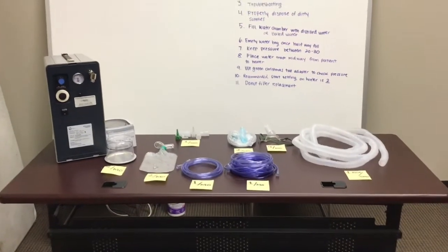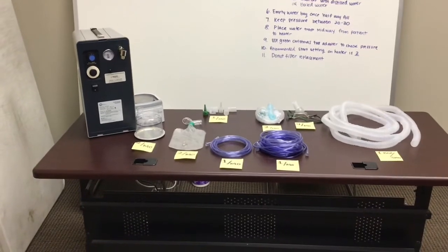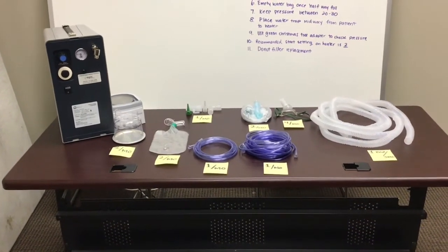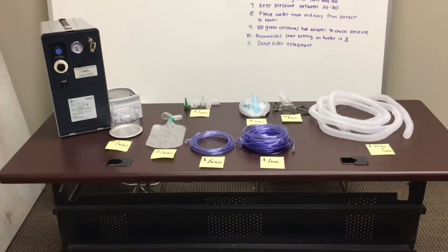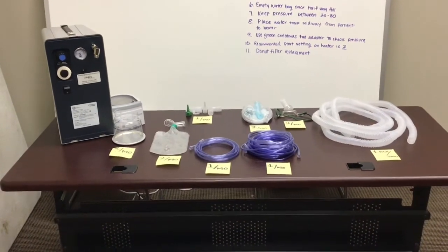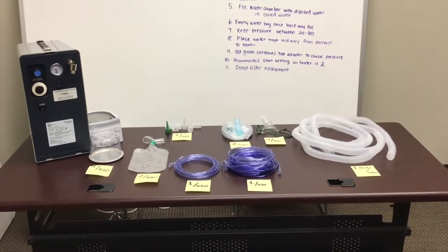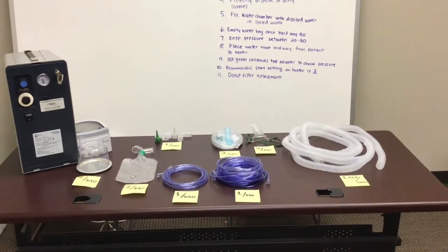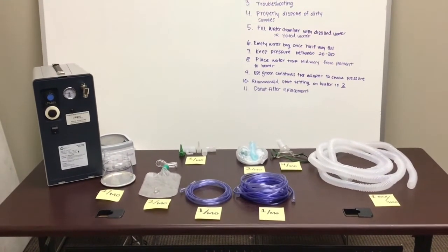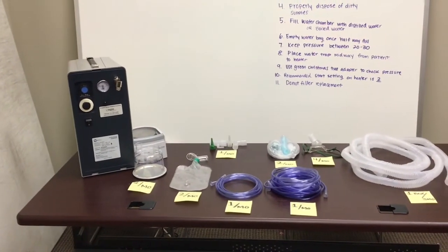Next, we will show you all of the supplies and how many you will be receiving. First, you will be receiving your water chamber 2 a month. You will be receiving 2 water traps a month. You will be receiving your Christmas tree, your pressure line adapter if needed, your concha adapter and elbow adapter once a month. You will be receiving your 7-foot tubing once a month. You will be receiving 25-foot oxygen tubing once a month. You will be receiving your nebulizer kit if needed 2 a month. You'll be receiving 4 trach masks a month and a box of 100 foot of corrugated tubing every 3 months. You will also be receiving your donut filter if needed to be changed.